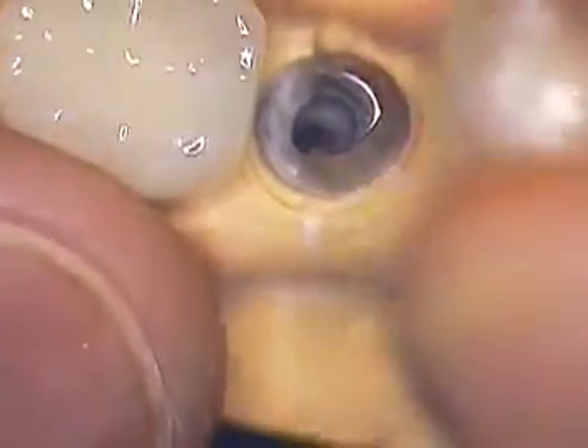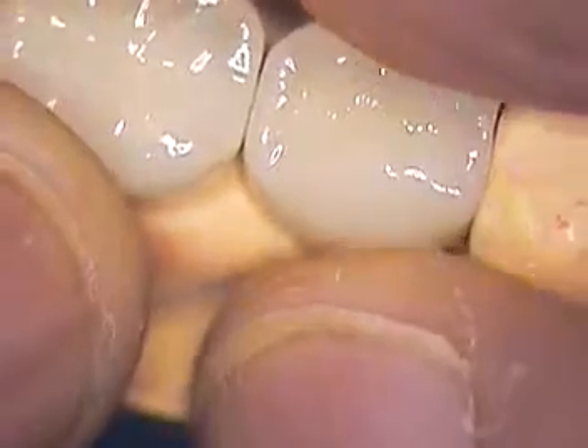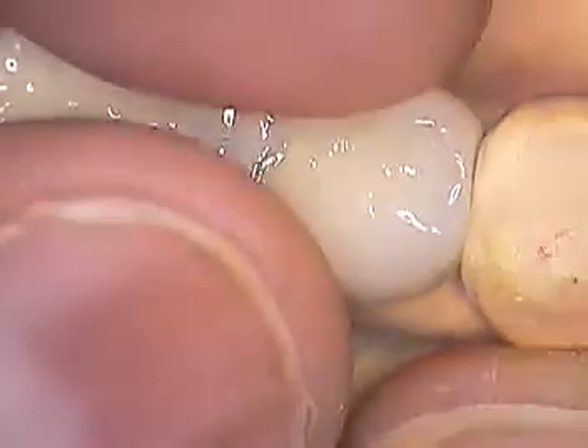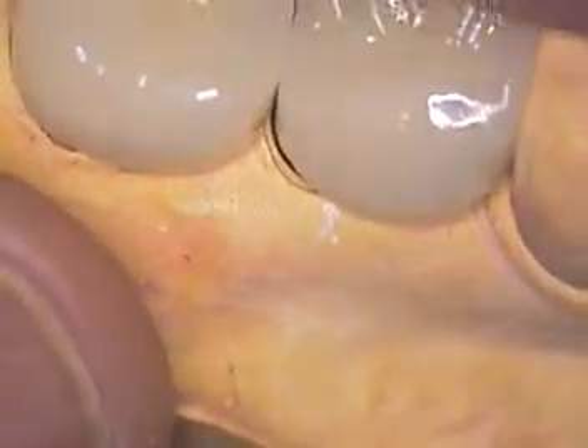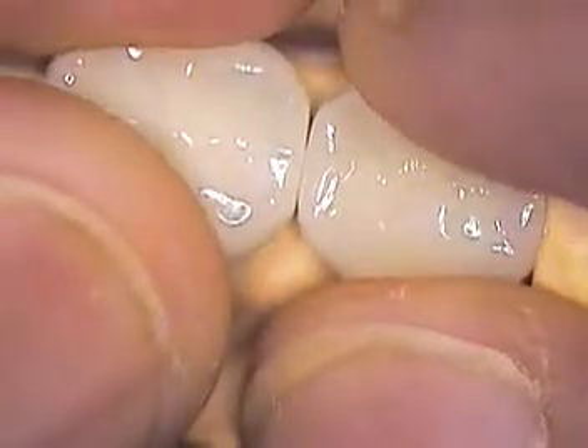Just to go over our issues: both abutments were custom made by hand by my lab and both crowns then fabricated. This one is the molar region with the ridge lap area. In the mouth we will be showing you the cementation technique as we did on other videos, hoping that we gain retention and resistance form from just the overall square dimension of the contact areas with a flat surface. Hopefully there won't be any rotational dislodging, and we rely heavily on our cement for the vertical retention in this case.